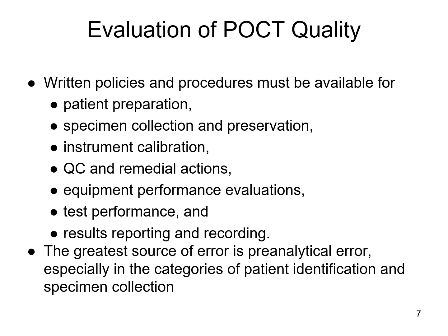The greatest source of error that we usually see is going to be anything that's in the pre-analytical phase. So this is usually going to be something like how the sample's collected, how it's stored, how it's transported, things like identifying the patient incorrectly, mislabeling samples, things like that.